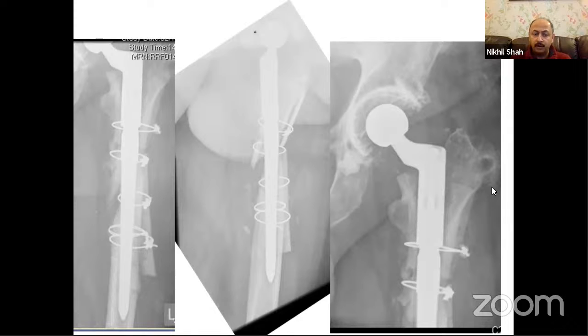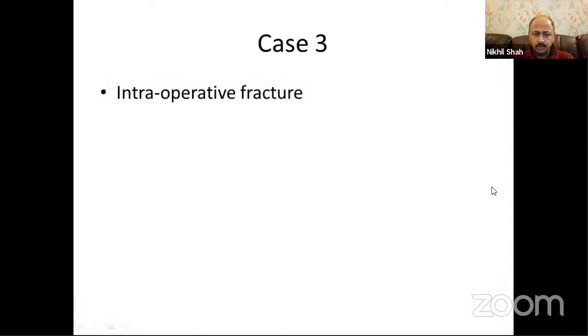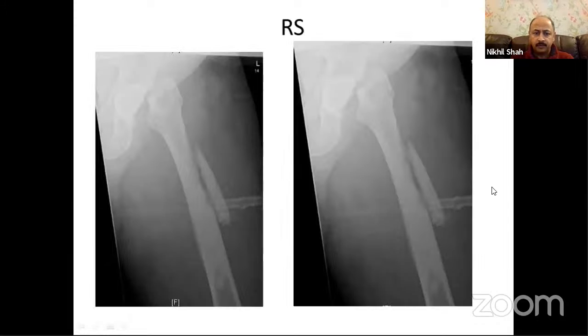When you try and put a very bold stem into a femur that is straighter, you sort of wrap the proximal fragment around the stem, but then whether it functions or not becomes largely irrelevant. So long as the abductors are maintained, it is doing its job. So let's look at some of these cases. So we get a lot of these referred to us.